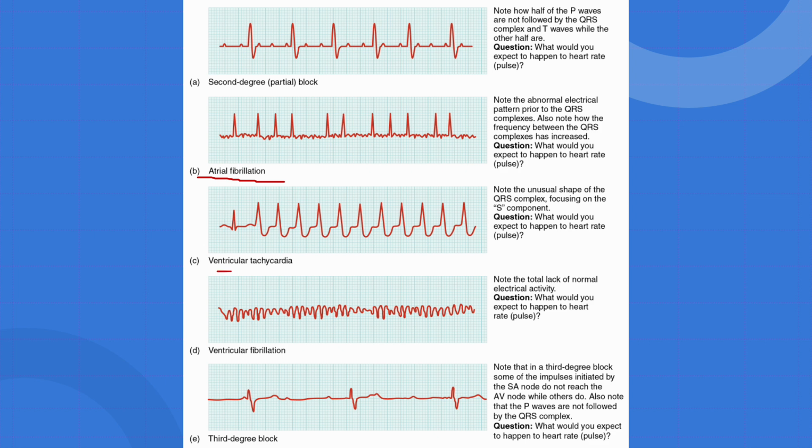Ventricular tachycardia. This is a rapid rhythm with wide QRS complexes, as you can see. They're often life-threatening and require immediate intervention. Bradycardia, which is a heart rate of less than 60 beats per minute. It can be normal in athletes, but may indicate conduction problems like sinus node dysfunction.